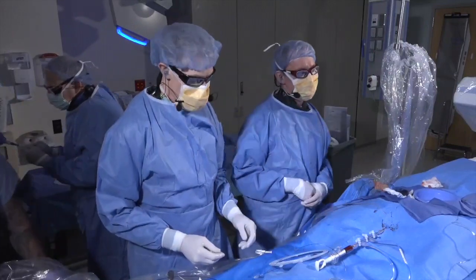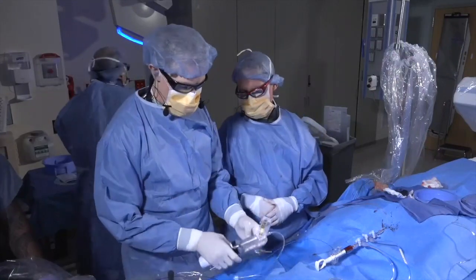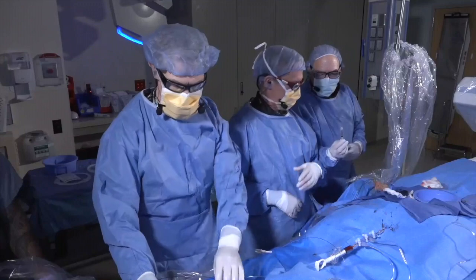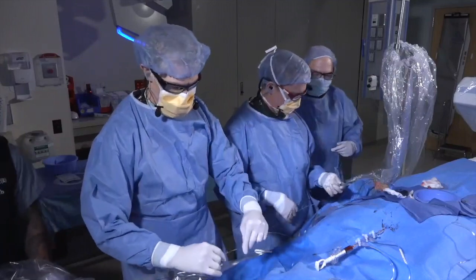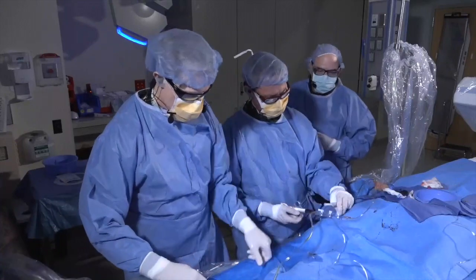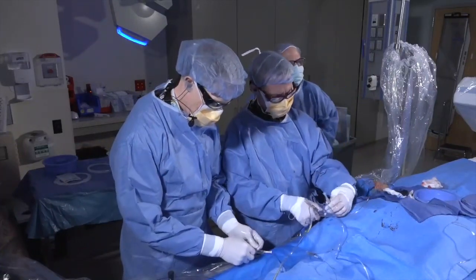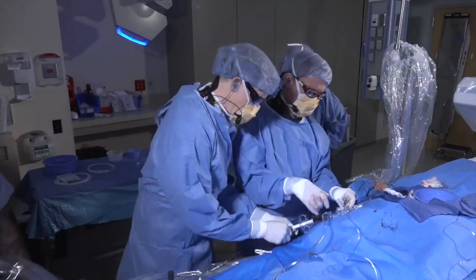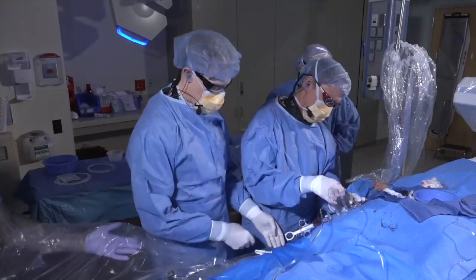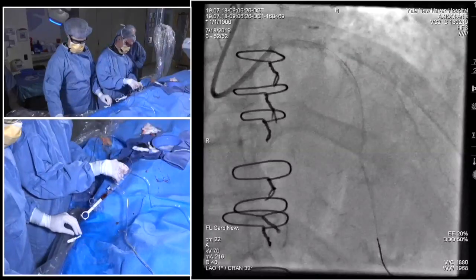Those are good cases to image. Kate talked about crossing of catheters. The one advantage, I'm hoping we'll get to see an HD IVUS being used here, is that the big advantage of that catheter over the conventional IVUS catheter that's used in most labs in the US is crossability. You cannot drive an Eagle Eye catheter through heavy calcification, tortuosity, and severe disease, whereas some of these other catheters actually cross a lot better. And the image quality, as you'll see, is likely going to be a night and day difference as well.